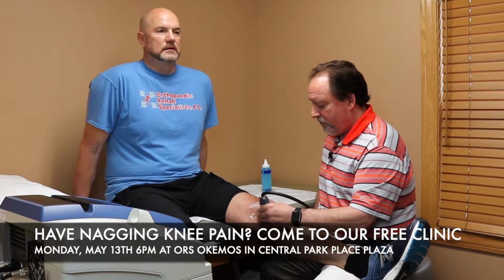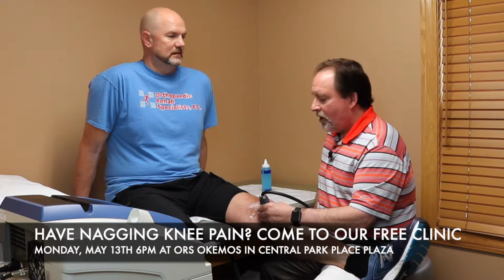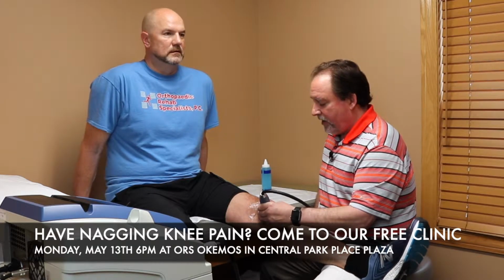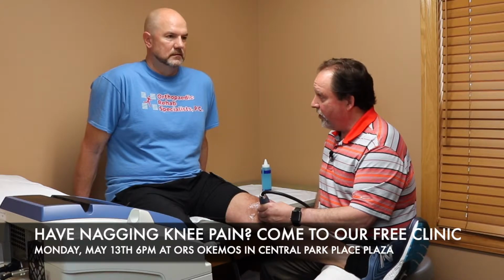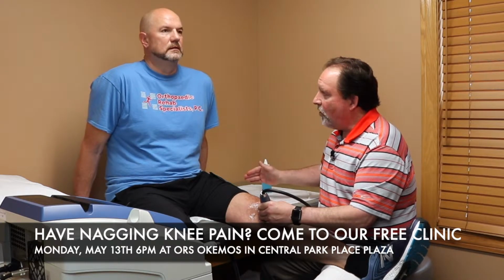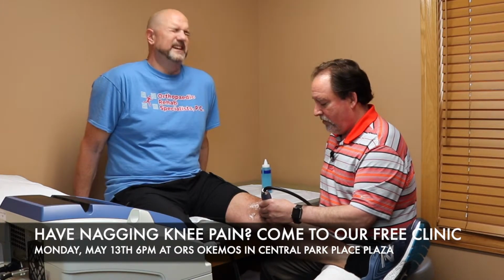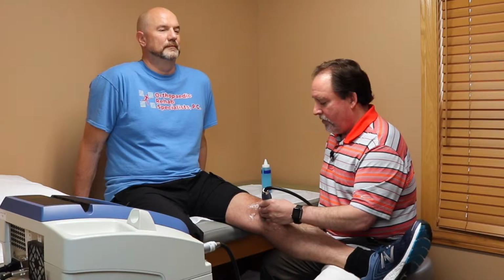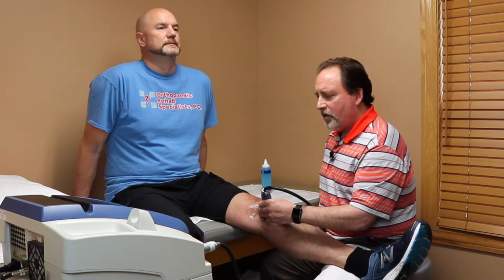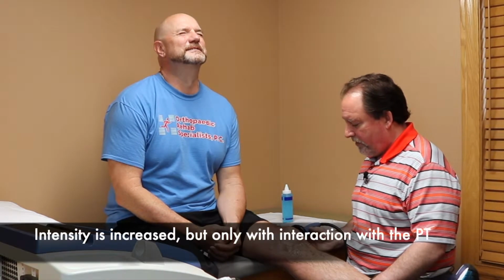Now, did it become more manageable only because we reduced the intensity? That's part of it. There are times when I can be right on the spot with a good intensity, and then it just kind of dies out. And at that point, you're okay. If you go to my left, right there, there's a new point. So we'll start another 500 on that spot.